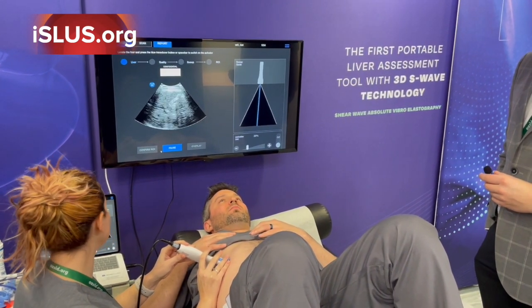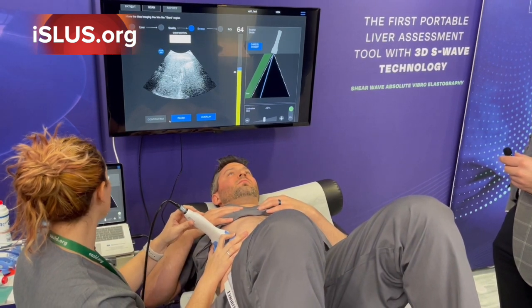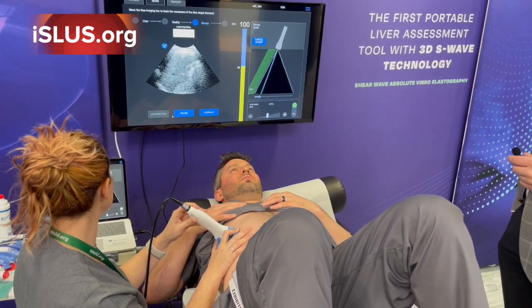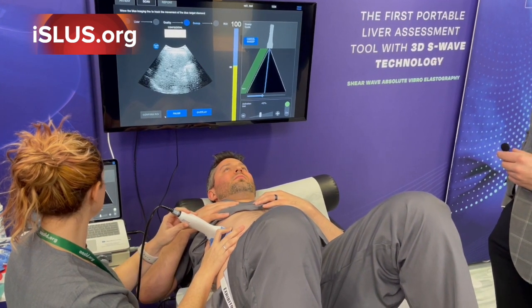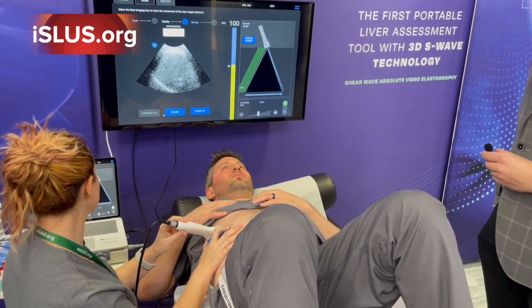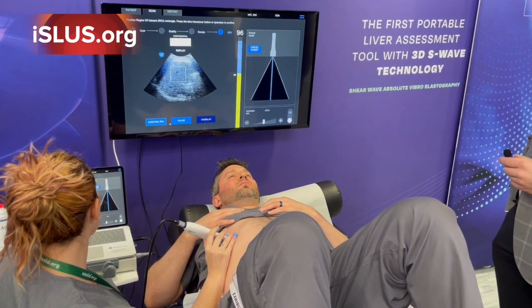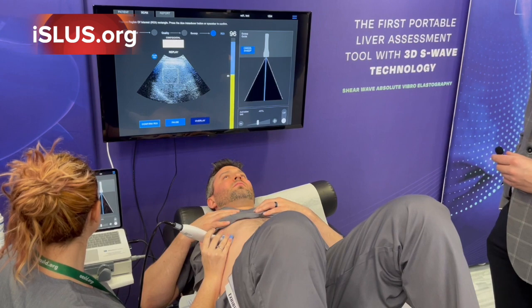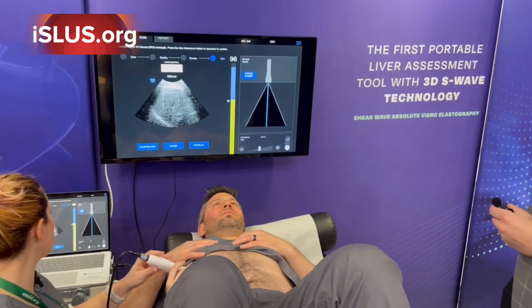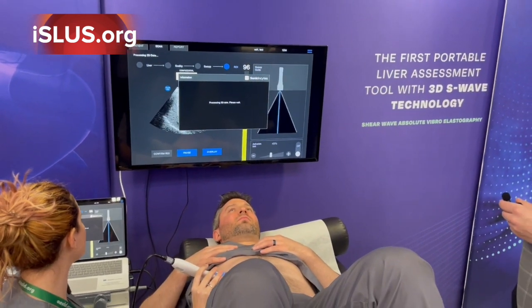Pad's going to turn on behind you. And we're going to move into our sweep stage. So go ahead, take in that breath again. Hold it for 8, 7, you can breathe. From here, if I needed to, I can move my ROI, which is my region of interest, into whatever area I think is best, to avoid the liver capsule. And then we'll hit our button on our probe again to move into our report screen.